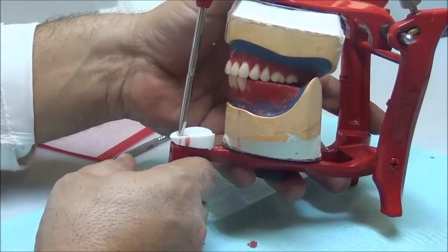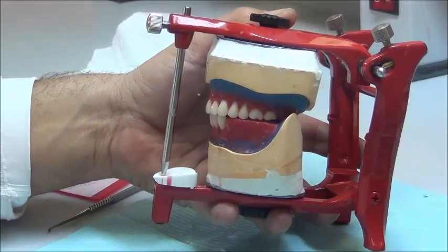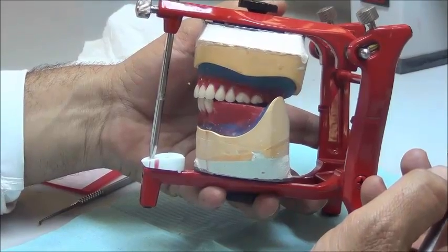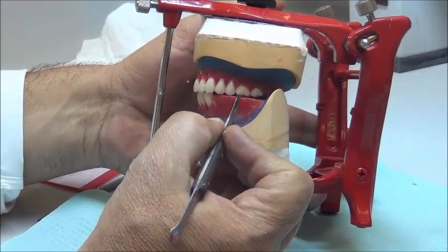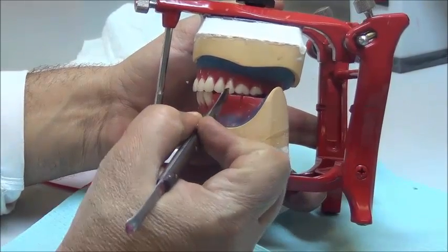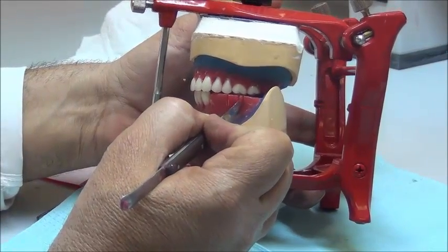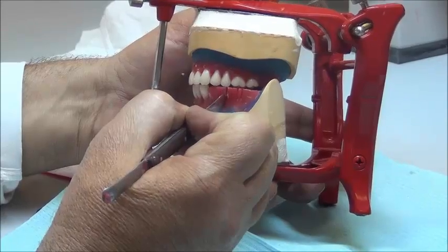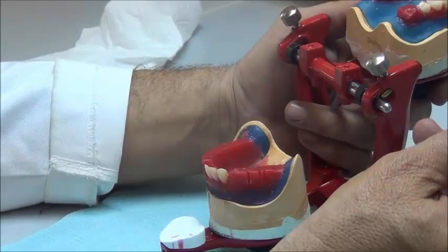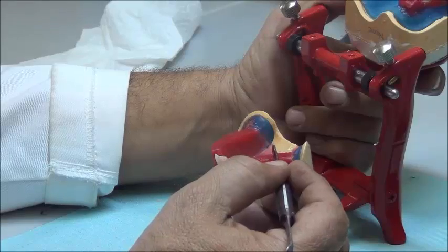Today we're going to talk about setting posterior teeth. After checking the quality for the upper and lower setting, we begin with the first step in adding posterior teeth. We're going to begin with tooth number 6. Tooth number 6, which is the first molar, is the biggest tooth in the arch, and its location is a bit to the mesial, so it's in between the mid of the upper 6 and the distal of the 5.